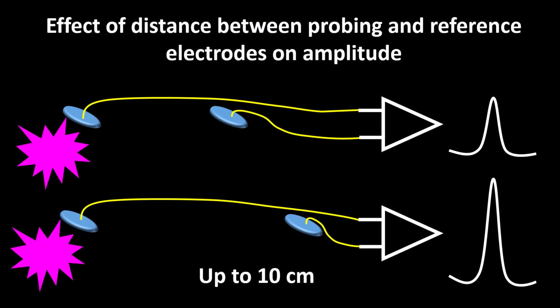If we have two probing electrodes localized at an equal distance from the source of an electrical field, the probing electrode matched to the furthest reference electrode will have a higher amplitude if both are only involved by the same field, as I have tried to show you in this frame.